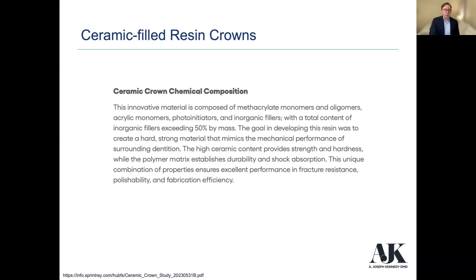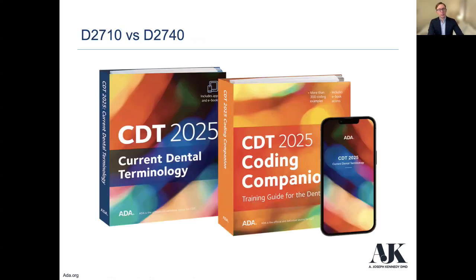So when we think about this, here is a top competitor's printed crown. They have resin. All of this stuff is resin because it gets cured, but it has ceramic aspects, these inorganic fillers, that now have a content of these fillers exceeding 50% by mass. So by definition, it does qualify as a porcelain ceramic crown. So it's just something to be mindful of. So again, these boring CDT codes keep coming back again.